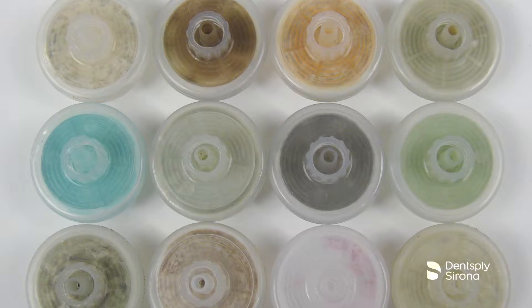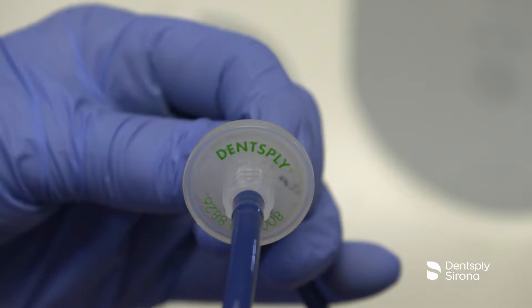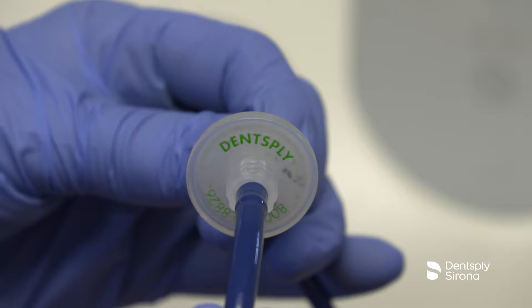When the water line filter becomes discolored, the filter should be replaced to prevent reduced water flow to the Cavitron Plus system. This should be checked and replaced monthly.